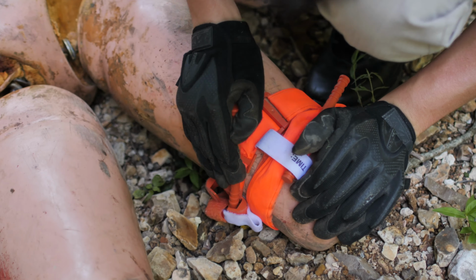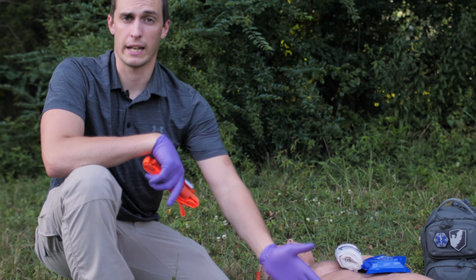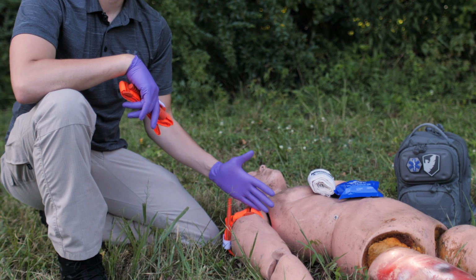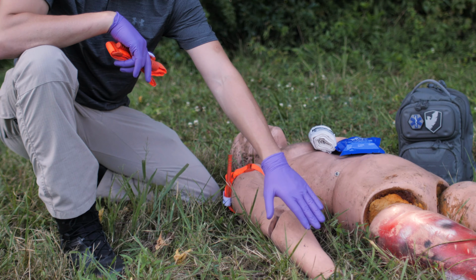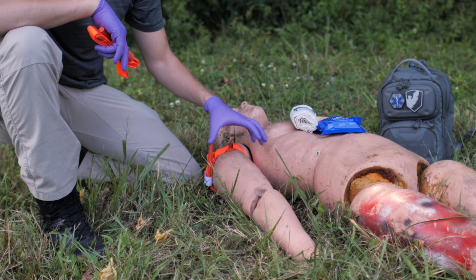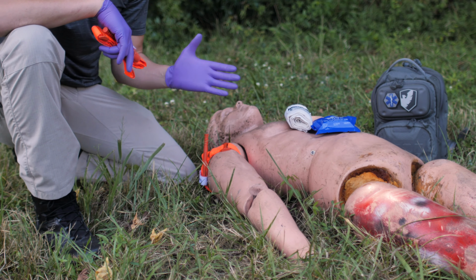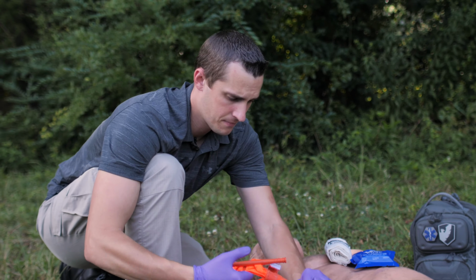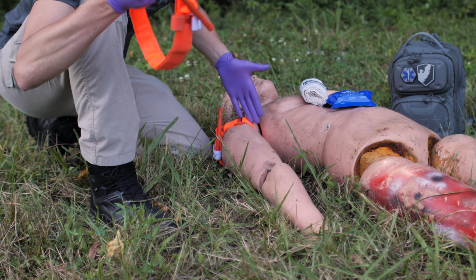So this would also be the time that we could relocate a tourniquet if we needed. So let's say on this arm, we have put a tourniquet high and tight. It is doing its job, but this was a hand amputation, and we now have a lot of tissue here that's going to be affected and not have blood flow. So if we deem it wise and necessary to move this, then we will take a second tourniquet. Don't take this one off until this one's in place.